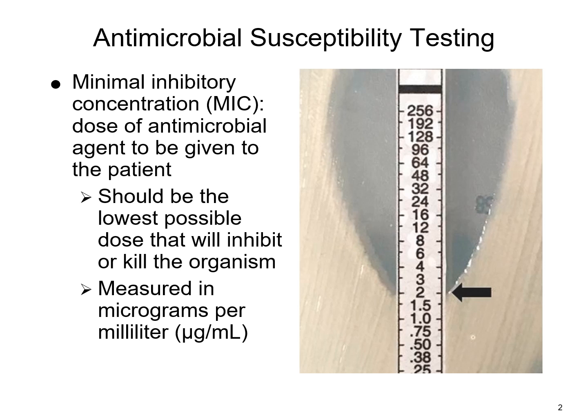Here is an example of an E-test, which is a strip with that antibiotic impregnated into a little paper strip. That's placed on that lawn of bacteria, and the antibiotic itself diffuses out, just like it did with those discs. You'll read to where that bacteria actually grows to.